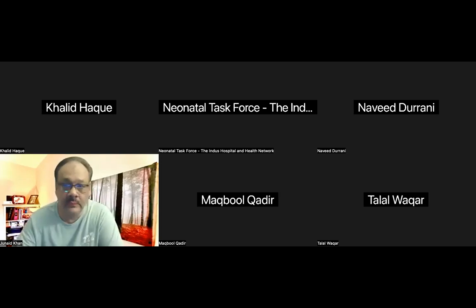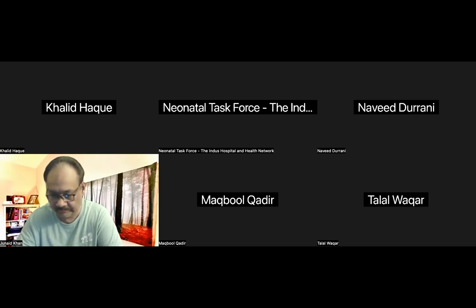Yes, I totally agree. Sometimes we just keep increasing the gain and we start picking up pathology. Also the depth: if you don't have the correct depth, the picture is too small or too big, then you miss the peripheries, or you don't appreciate the normal structure. So the picture has to be central. You should see from top to bottom. That should be your appropriate depth.